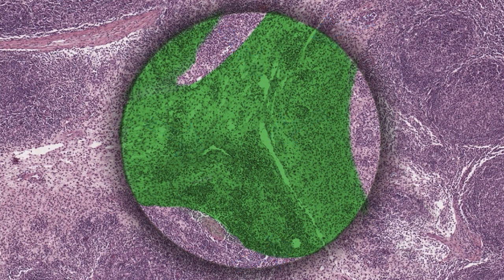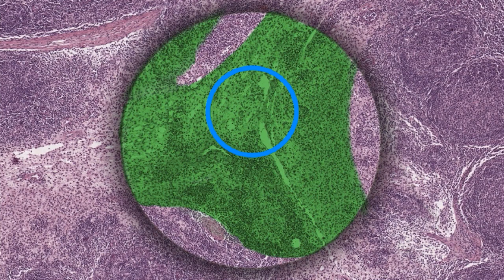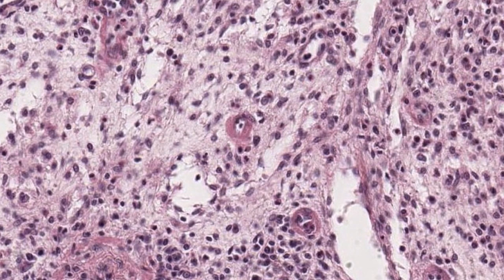Throughout the lymph node, including within the lumina of the sinuses, runs the reticular connective tissue, which is what we are particularly interested in right now. To get a closer look at it, we'll zoom in on the highlighted area. So if you remember those sinuses we pointed at, this is one of them just here. So now that we've orientated ourselves a little, let's move on to the rest of the tutorial.